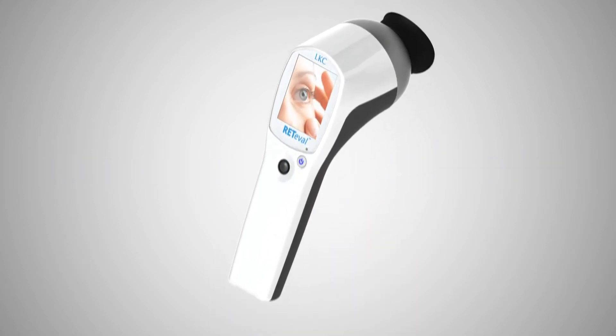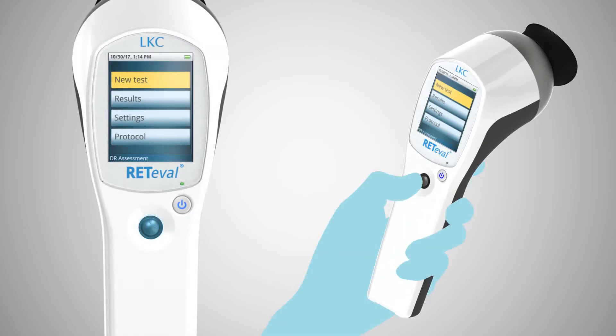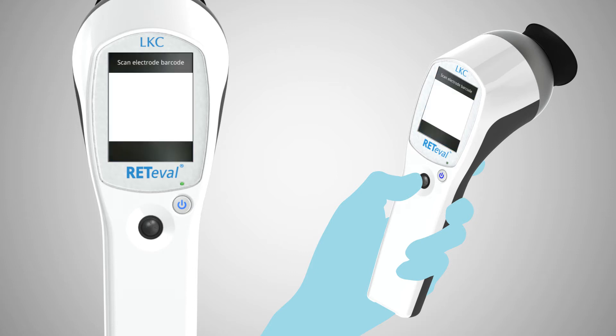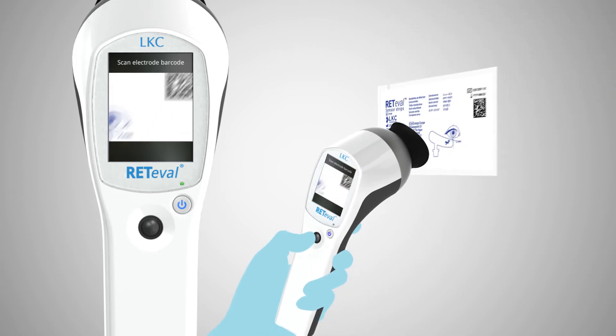First, remove the device from its charging cradle. Using the built-in user interface and joystick, enter the patient ID and birthdate. Scan the barcode on the single-use sensor strips using the built-in scanner.